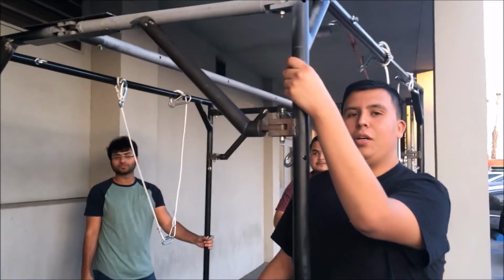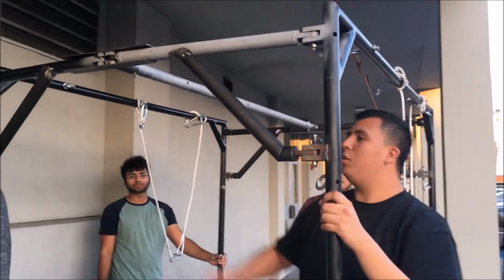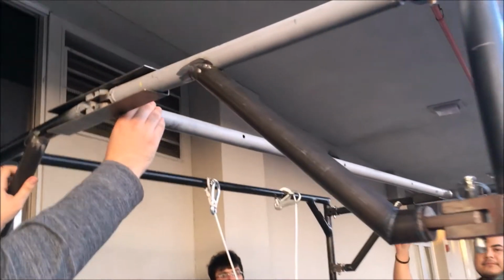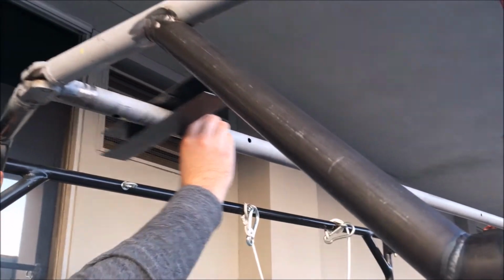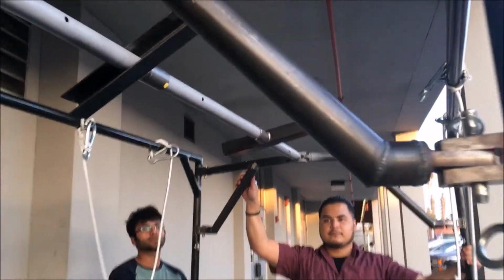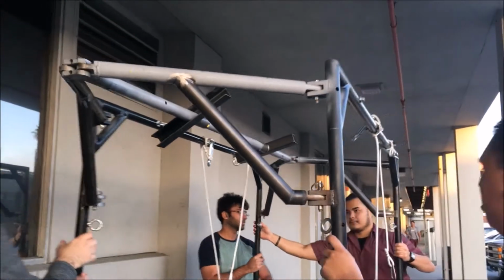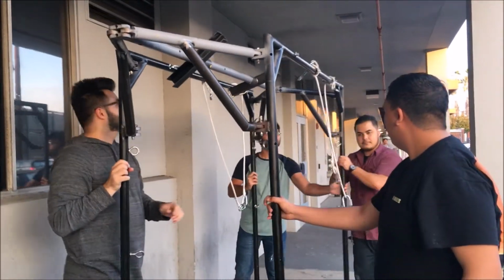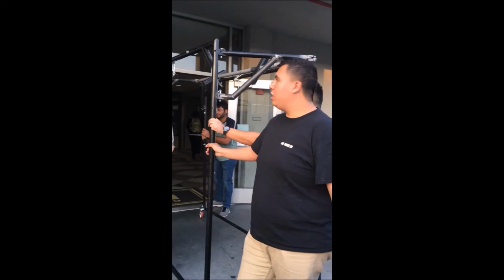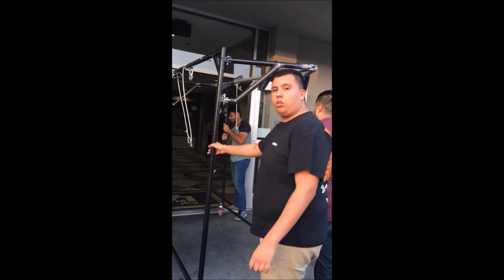Alright, so the first step to remove the spider cage is to remove the bolts. And after that step, you slowly bend this part to slide the things. And then you start folding. Alright, so with this design, it's easily accessible through doors.